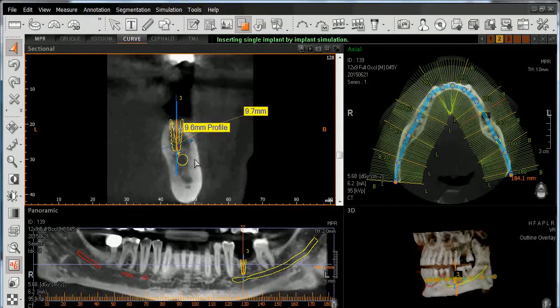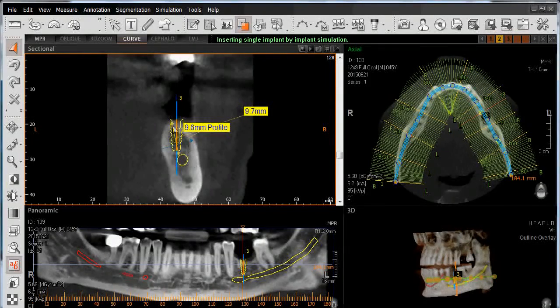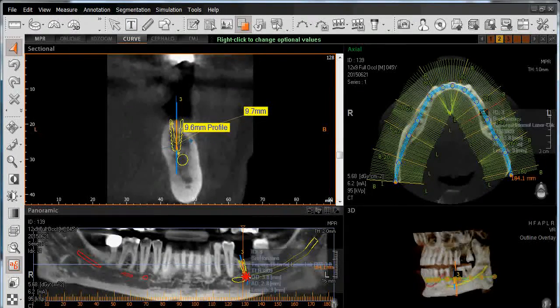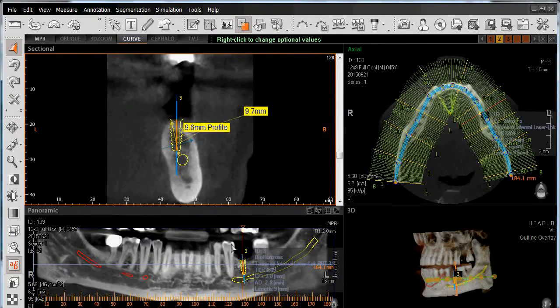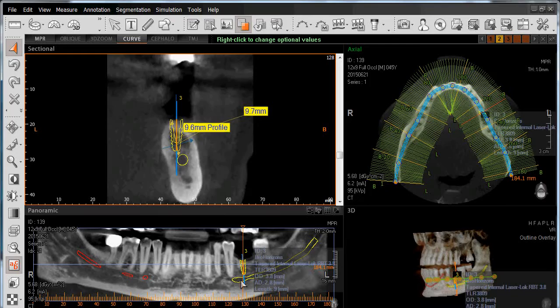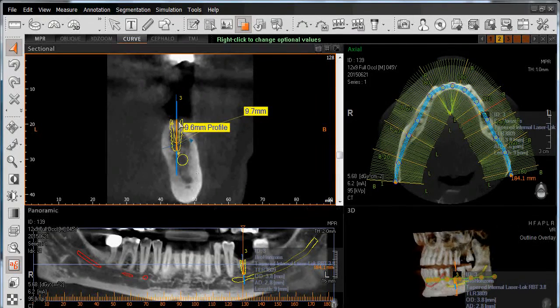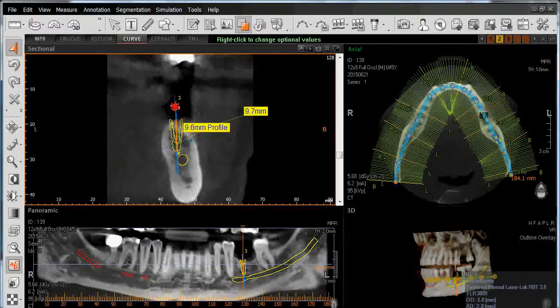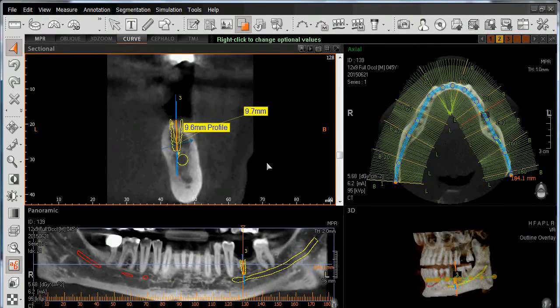To continue moving it bodily, you can do it either in our sectional view or in our panorama view as well, to align it perhaps as it relates to an adjacent tooth. To change the angle of it, left-click on the blue line accordingly.